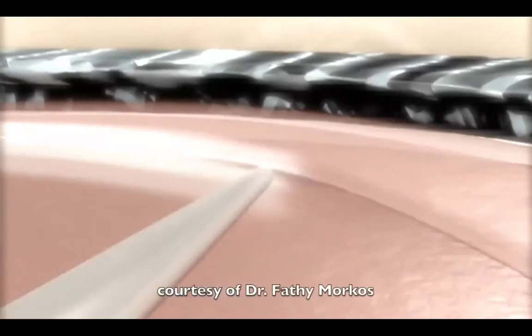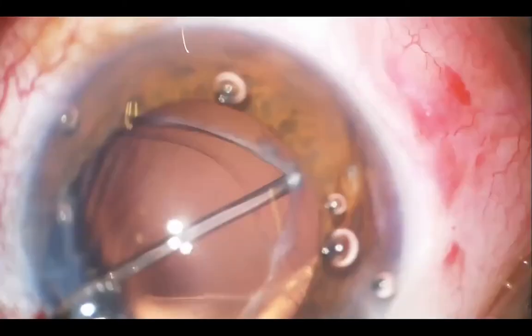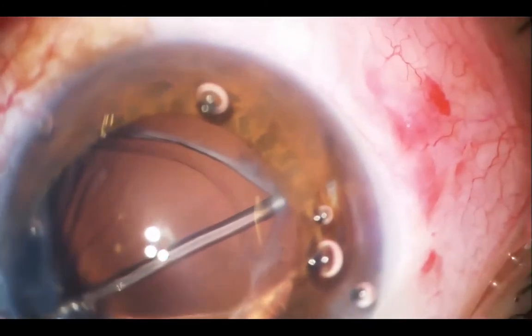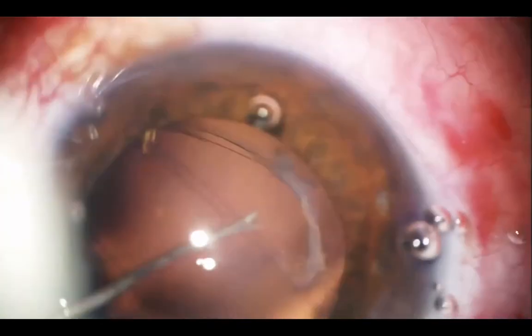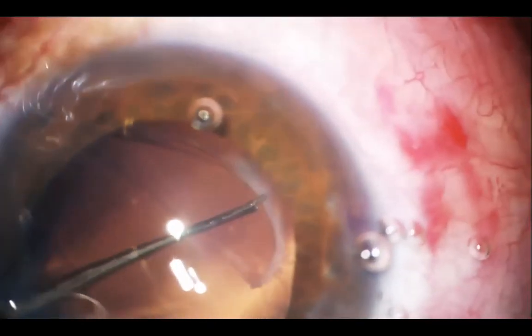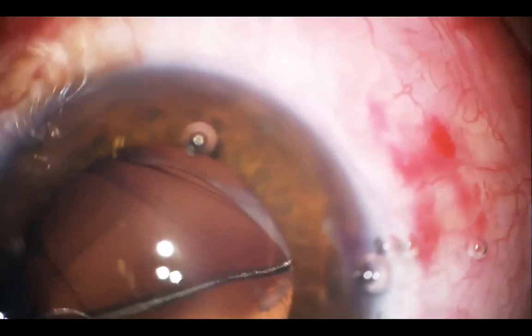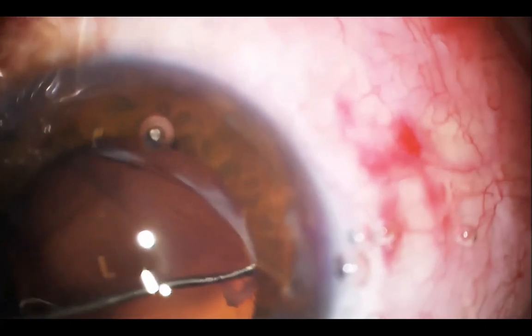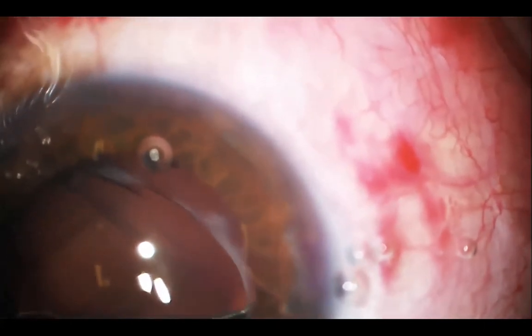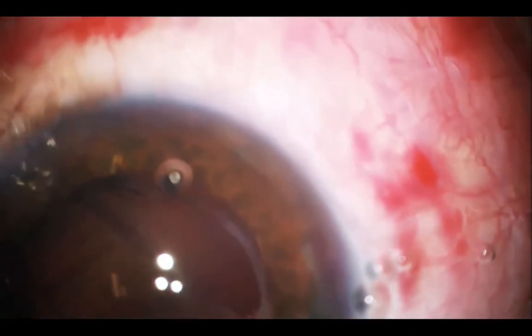And I remembered he showed in his video that the areas of maximal fibrosis, or the white area at the edge of the capsulorhexis, were probably the easiest areas to start the dissection. So I followed the same tactic, and with the blunt dissector and blunt instrument, I'm trying now to dissect with the aid of dispersive OVD between the anterior and posterior leaflets of the capsule.